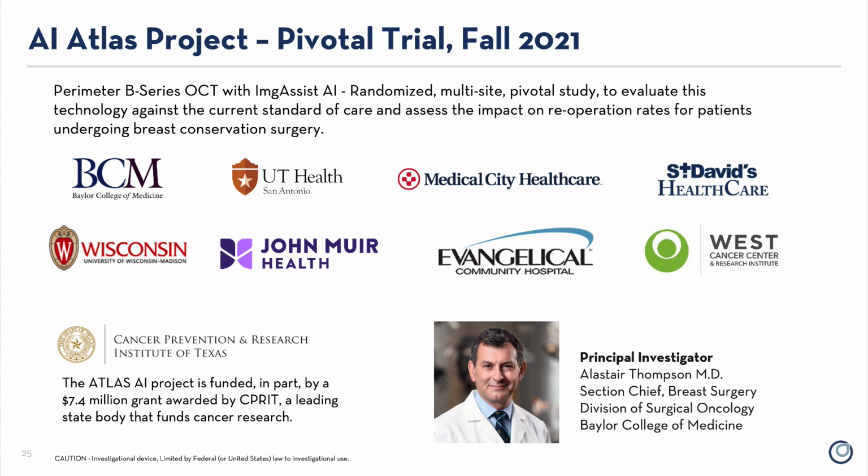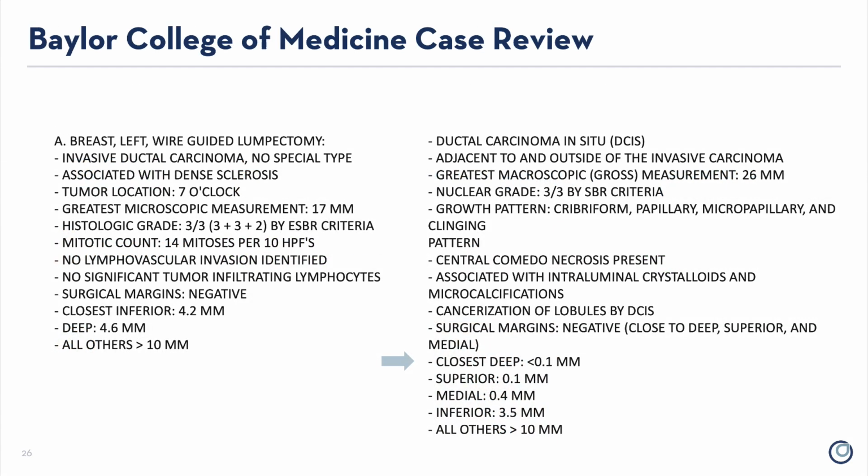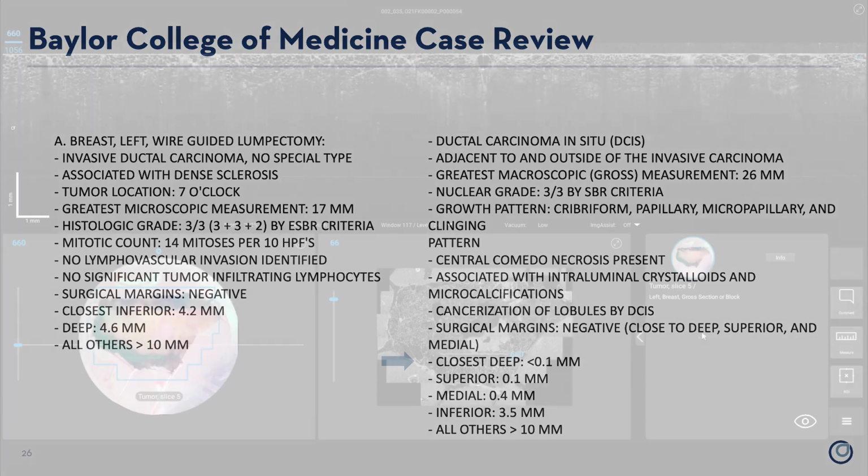The goal of the study is to evaluate OCT with integrated AI against the current standard of care and assess the impact on reoperation rates for patients undergoing breast conservation surgery. Now let's go to a Baylor College of Medicine case from one of my colleagues. Here's the pathology report. We can see at the arrow we have a close, deep, and superior margin.